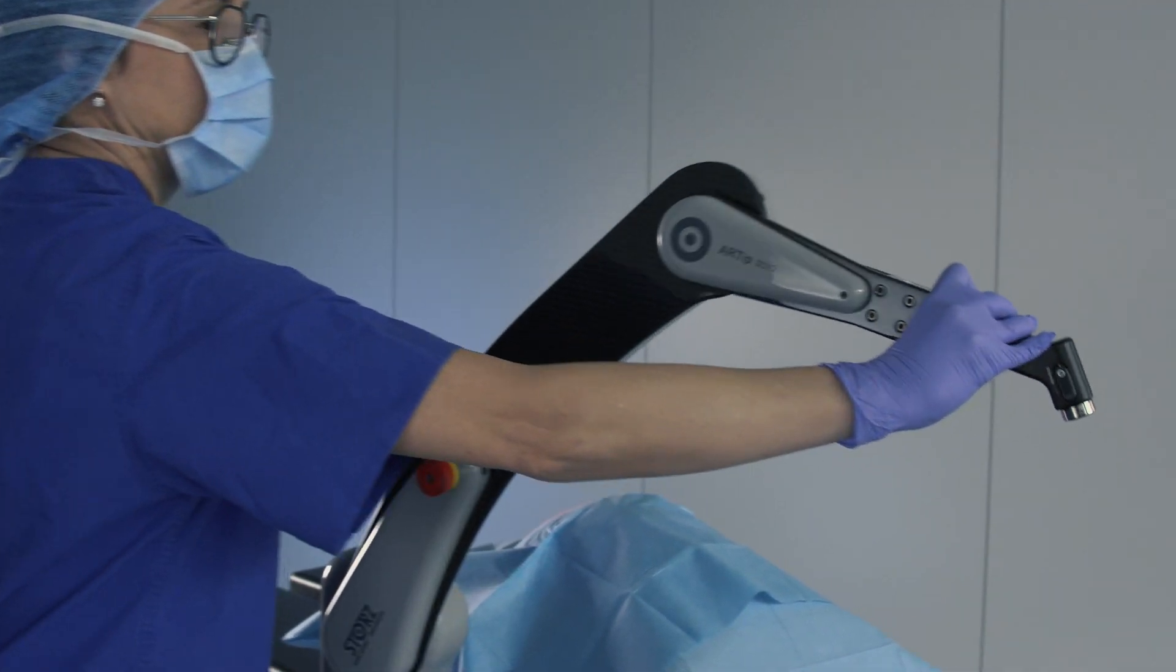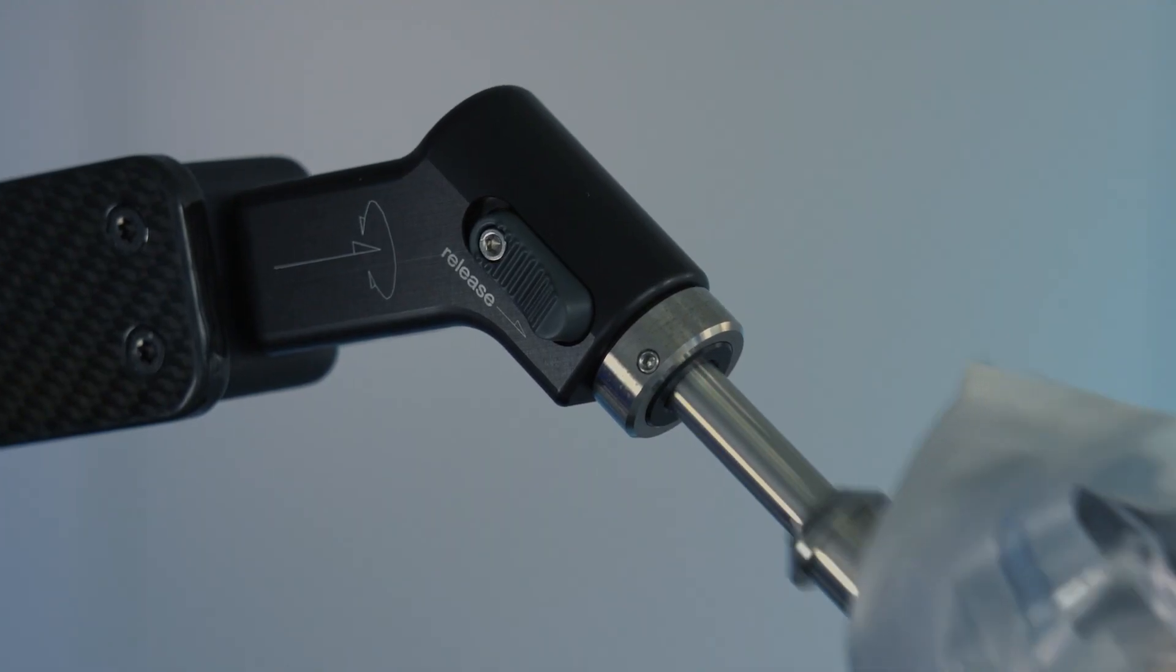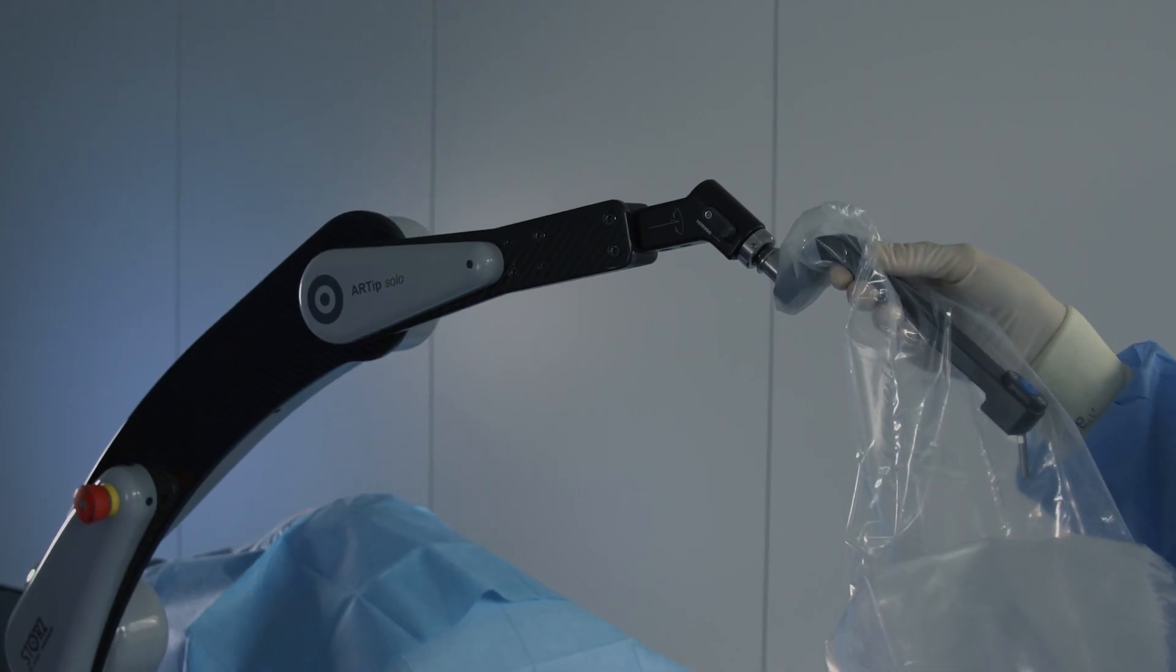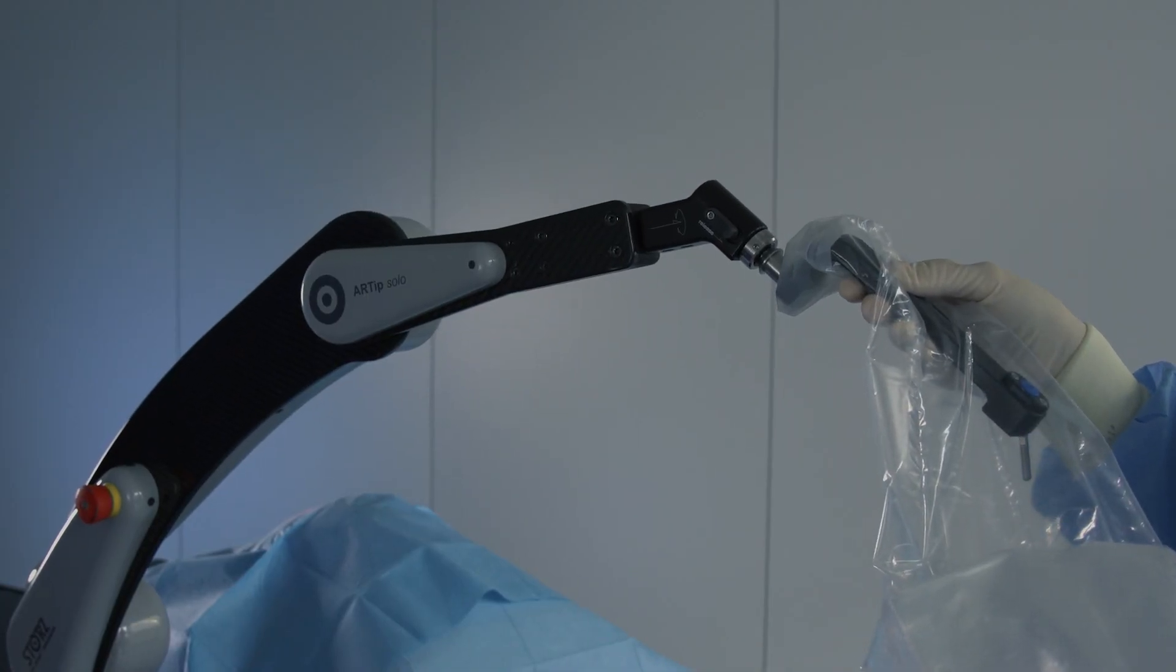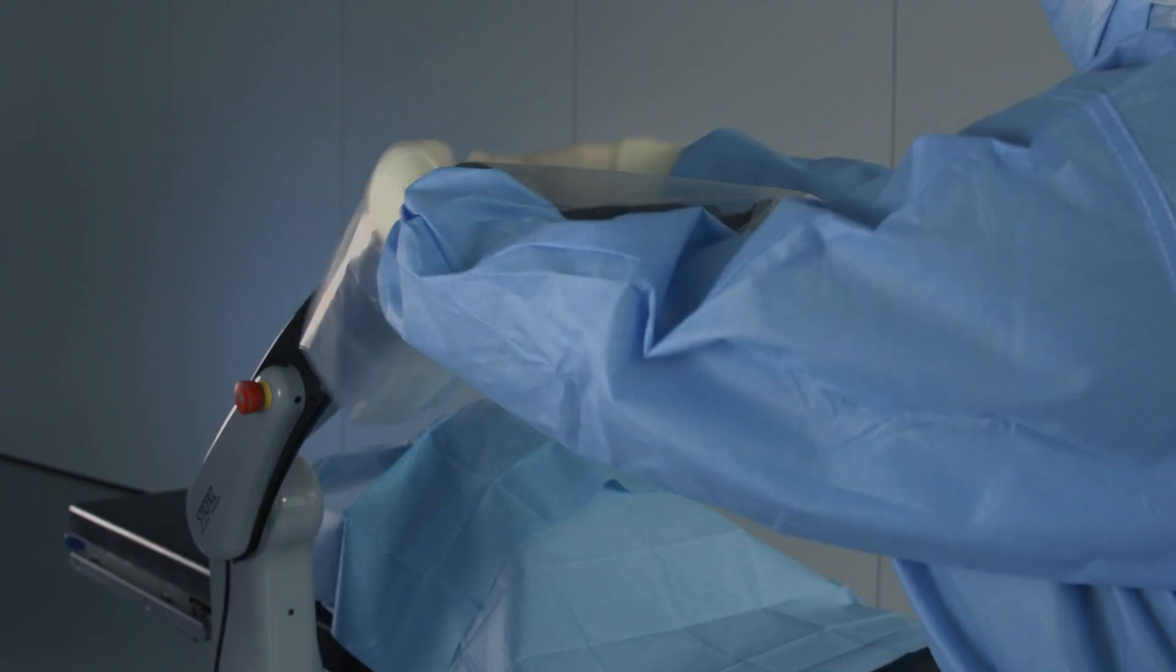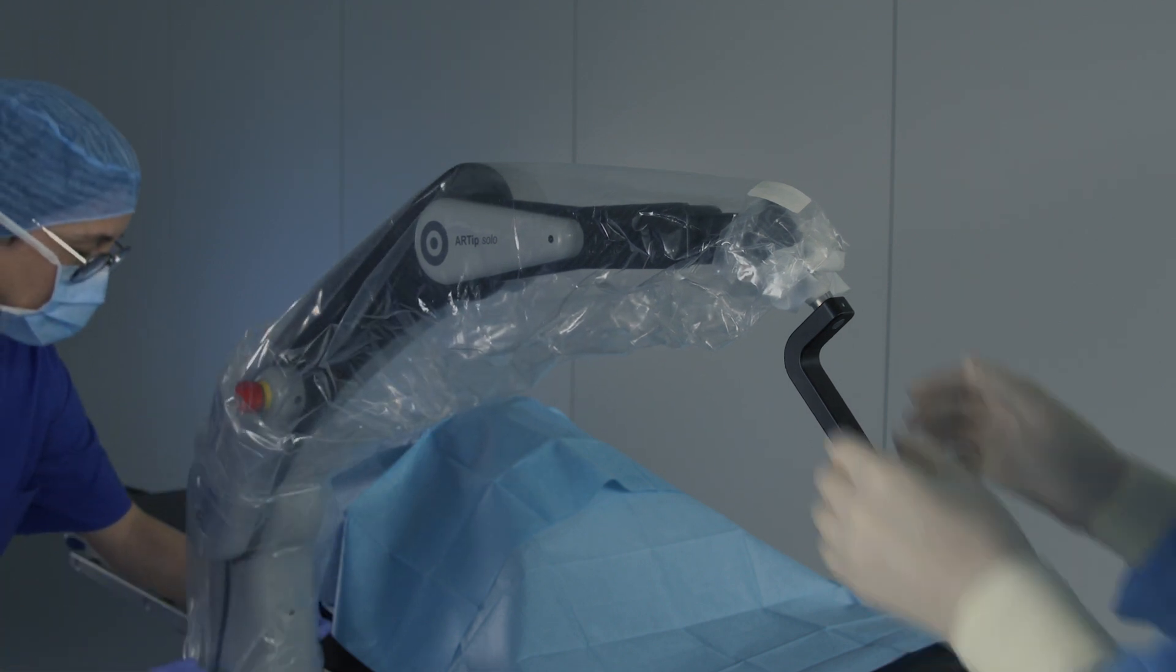Guide the sterile covered universal joint to the holding arm from below. Push the pin of the universal joint into the holding arm's connector until the universal joint locks audibly into place. Pull on the universal joint to ensure that it has engaged correctly. Take hold of the sterile cover and pull it over the arm. Pull downward together any excess length of the sterile cover.